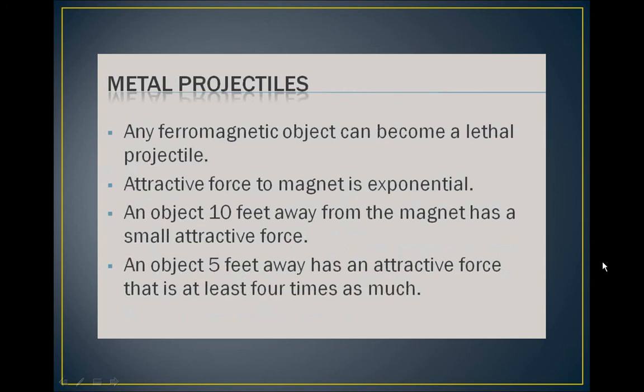Know what the terminal velocity of a paperclip is when being pulled into a 1.5 Tesla magnet. This will be on a quiz and can be found in your MRI practice, chapter 10.